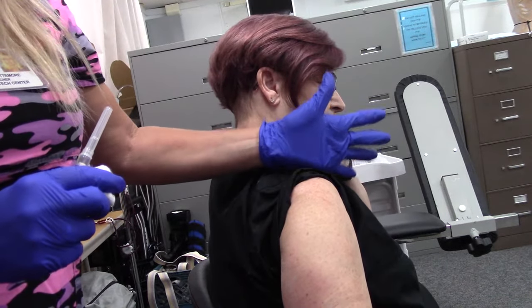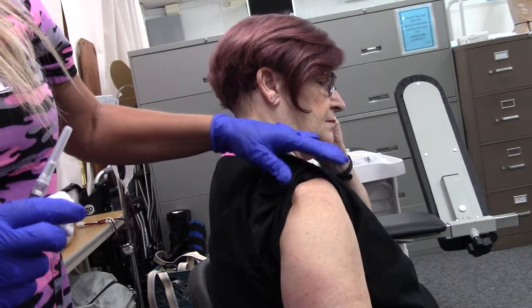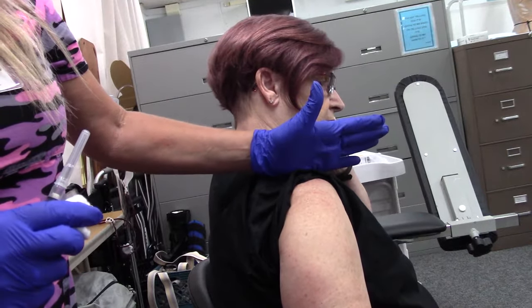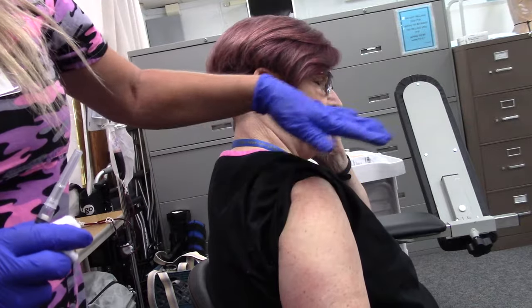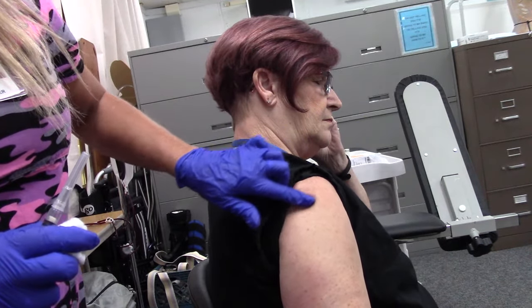We're going to put our hand on it. We need to be at least three fingers down from the top of the shoulder because there's bone there. If we put our hand on the acromion process, we'll be able to grab that deltoid muscle without touching the top three fingers. Here is where my fingers end.